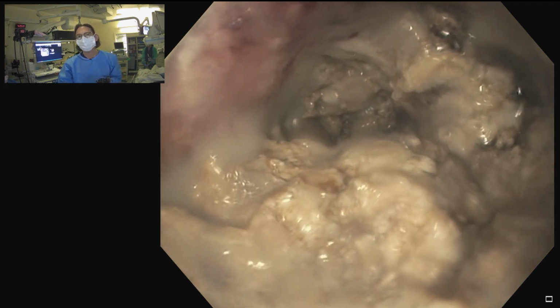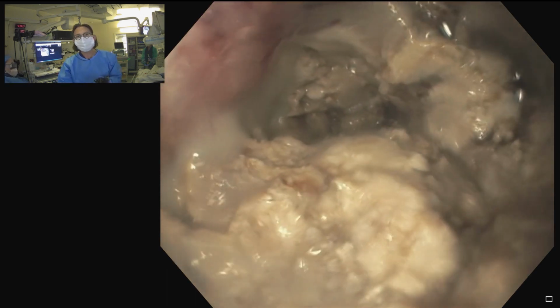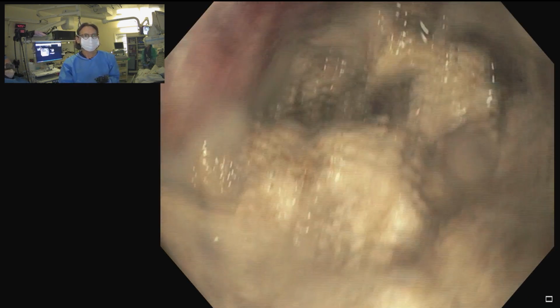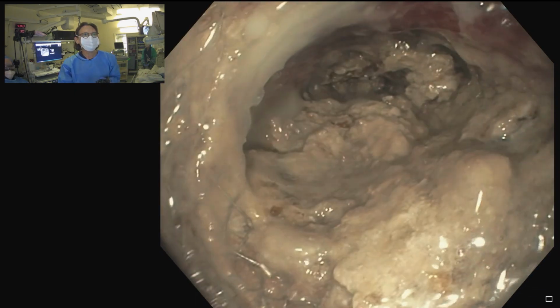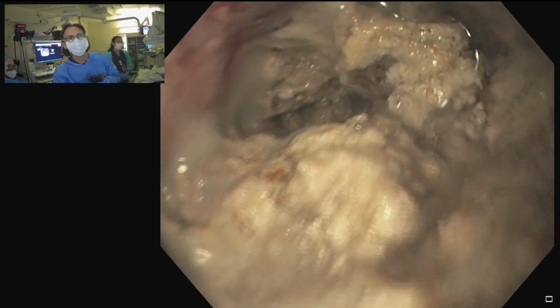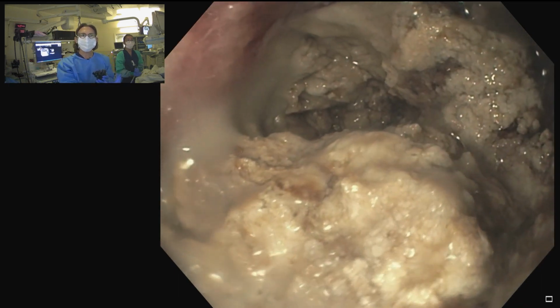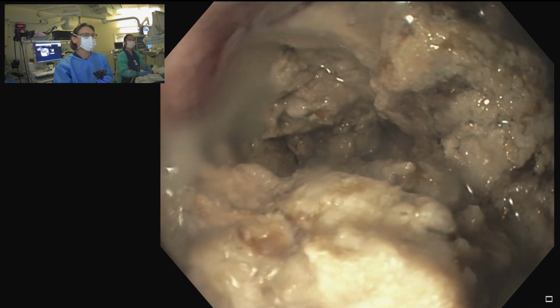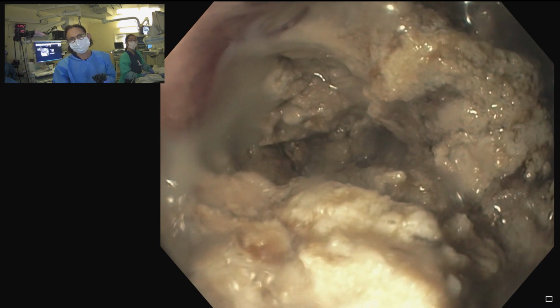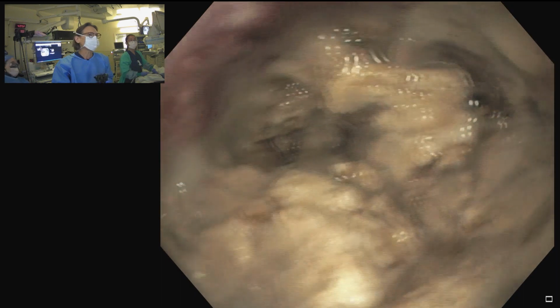In addition, there is also a sheath attachment that you can apply to a standard gastroscope to pass the 5.1 millimeter diameter EndoRotor. So on my way out then, this is how it looks. And I've asked my nurse to inject some methylene blue through the percutaneous drain just to see if I can see any of that emerge from the depth here. Go ahead. So we might see something, but we may not because it's so loculated and it's down in the pelvis. So she's irrigating down just with saline.